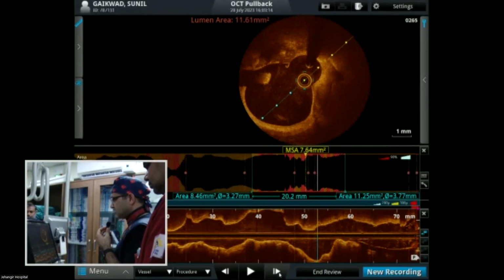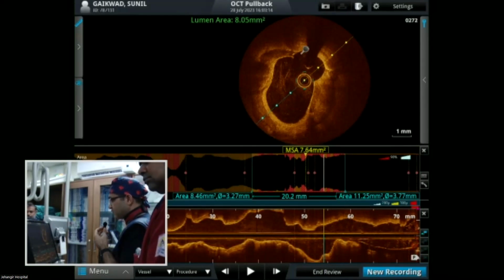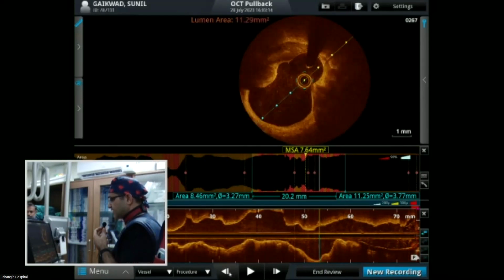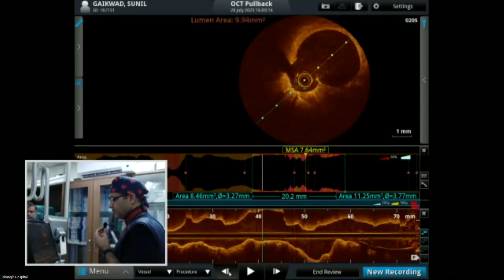Can you see the amount of destruction that there is, again smoothing? This time the wire was slightly away from that cupping, so it has modified the other side. Number one. Number two, let us go and see what has happened to the distal nodule.